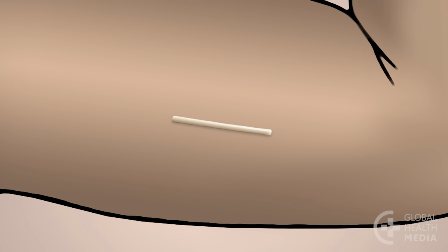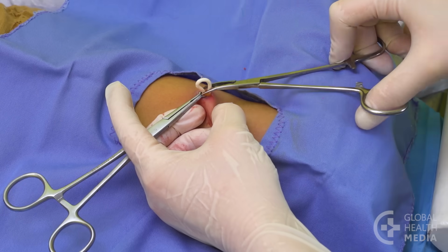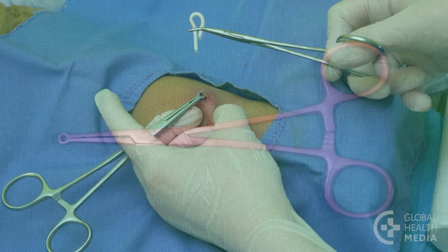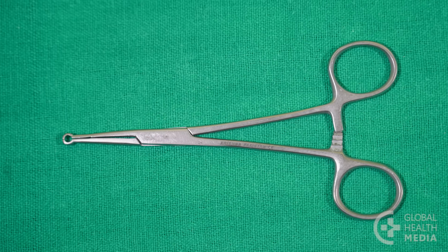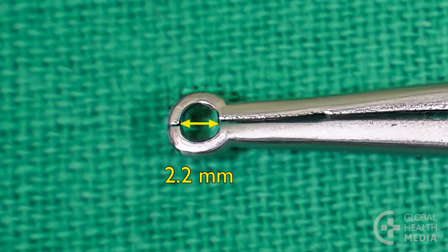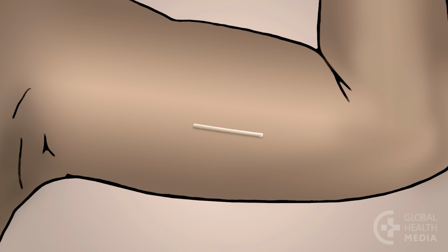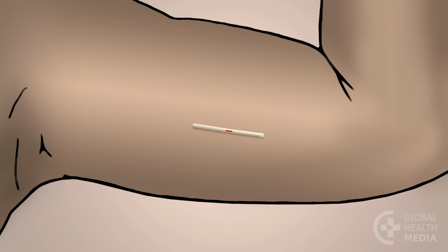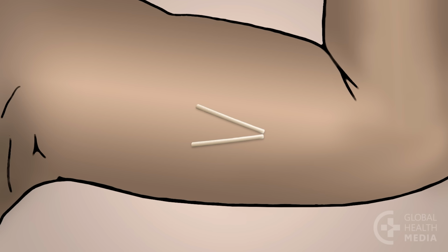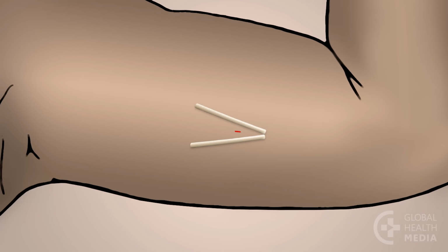And last, we show the modified U technique. It can be helpful for a more difficult removal. Modified vasectomy forceps with the 2.2 millimeter ring works best for this procedure. First, mark the incision site. It's directly over the middle of the single rod. For 2 rods, the incision site is between the 2 rods and 1/3 up from the end of the rods.